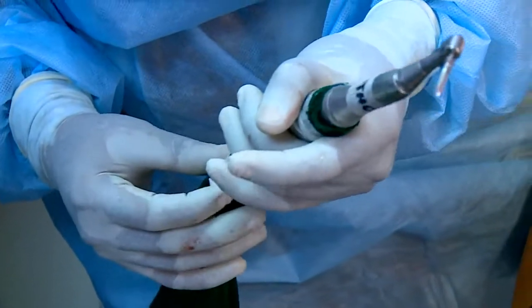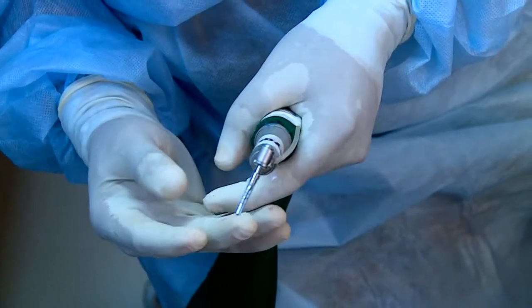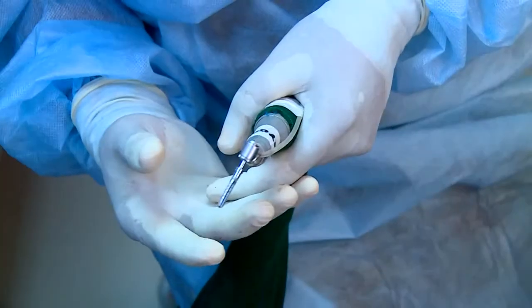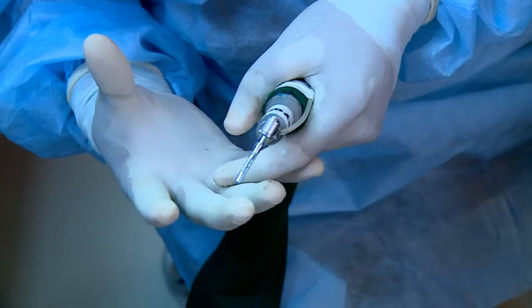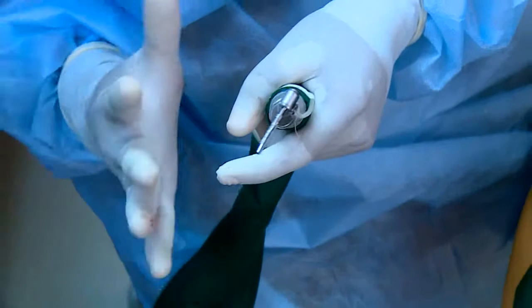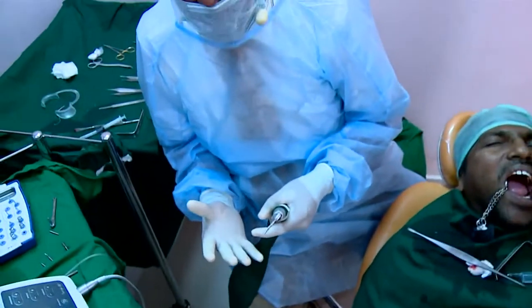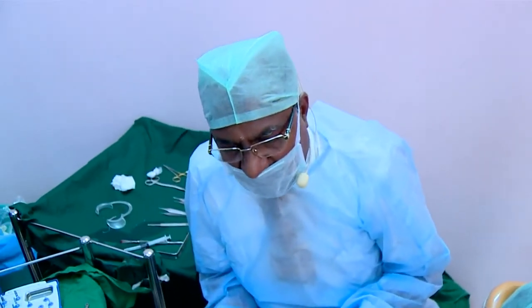So sometimes, ideally, in a maxilla you have to under-drill. But in the mandible, if it is dense bone, we do talk about qualities of bone. In the anterior mandible, you are likely to encounter very, very dense bone. We call that D1 bone. In the posterior mandible, most of the time you end up with what we call D2 or D3 bone, which means we have a fairly good cortex with compact cancellous bone. Here I think I am looking at D3-ish bone rather than D2-ish bone.